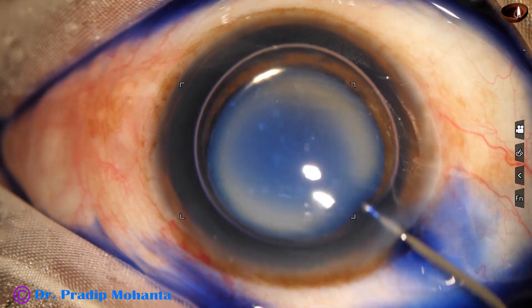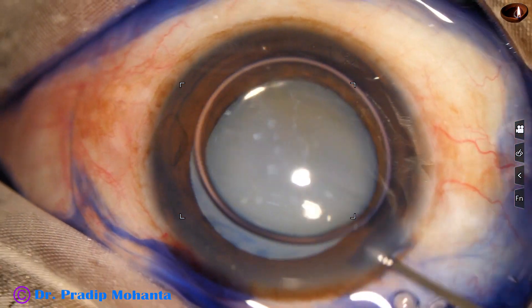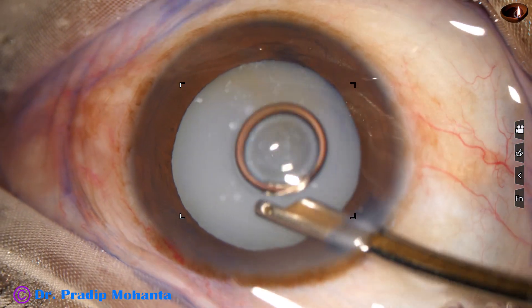Now, what is a hypermature morganian cataract? It is that as soon as you make a puncture onto the anterior capsule, milky fluid comes out.